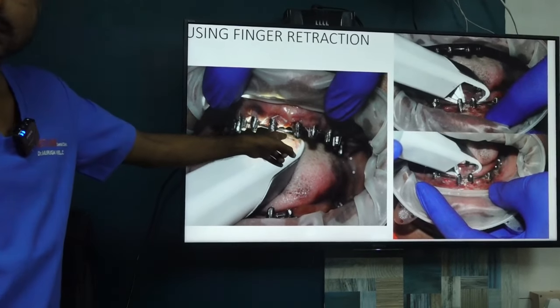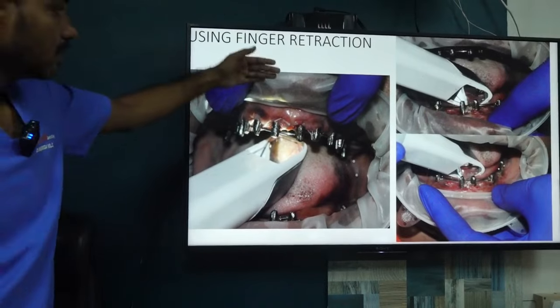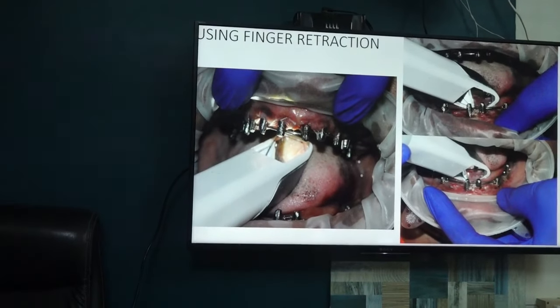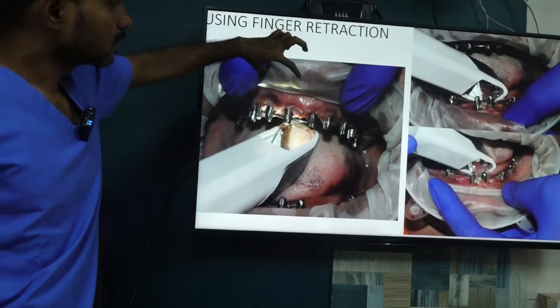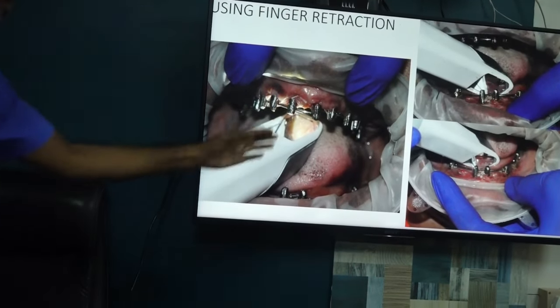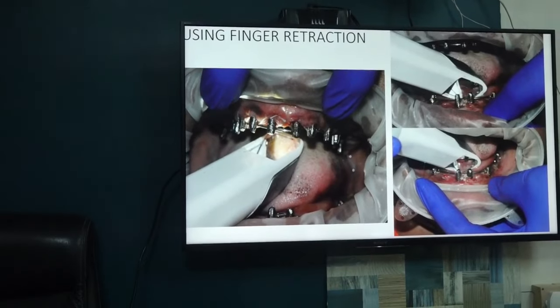Okay. When you scan palatally in the anterior area, the lip will come down and it will produce double scanning. So you have to use two fingers to retract the lip when you cross this segment, when you cross this curve.